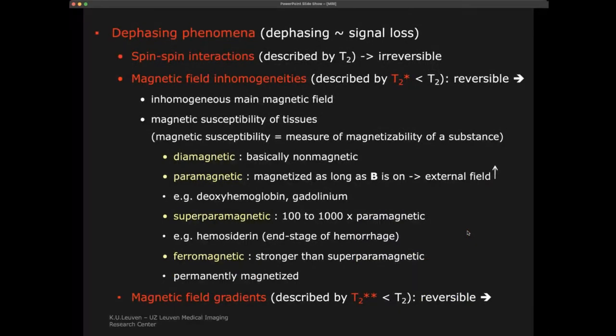Okay, so the thing is, this now relies on the fact that we are trying to measure this relaxation phenomena, and we assume that the amplitude of the vector that we measure is related to this T1 and T2 relaxation. Now, the thing is, there are other things that would also change the amplitude. And one thing is that, of course, while we are measuring and we want to emphasize the T2, there is a T1 relaxation already going on, and that we don't see.